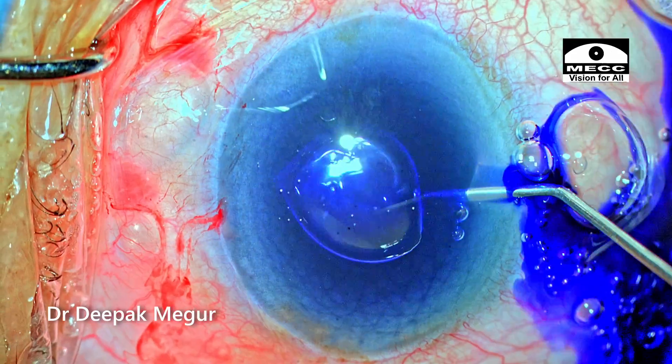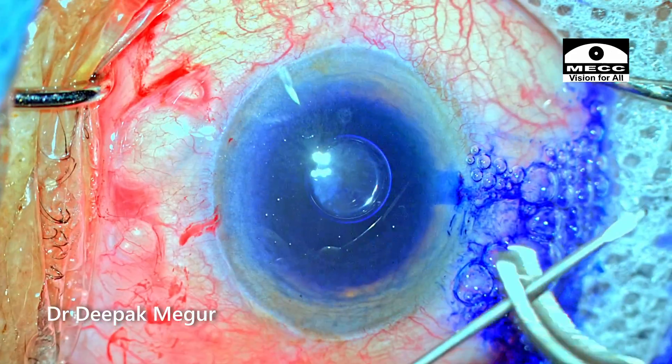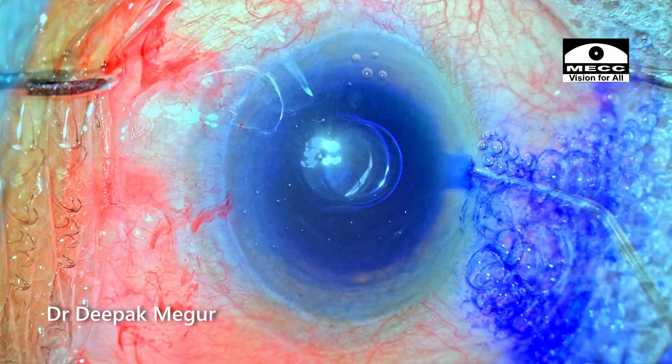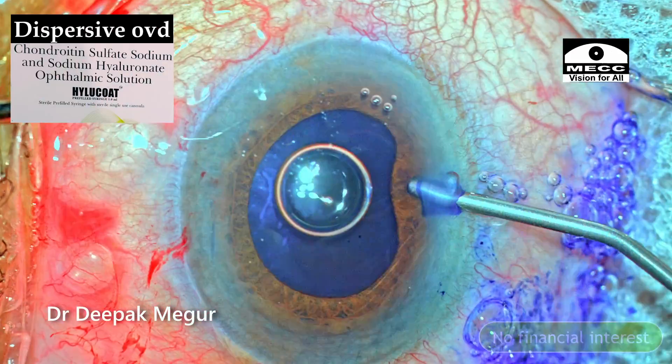Trypan blue is used to stain the capsule. In the meantime, I'm bending the capsulotomy needle to give enough time for the dye to stain the capsule. BSS is used to irrigate out the dye. Now is the time to inject OVD.